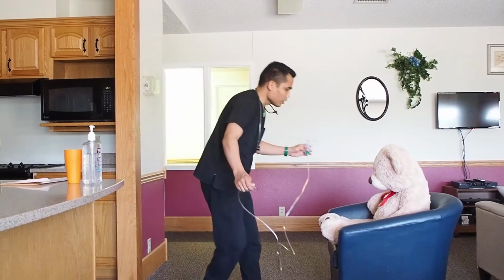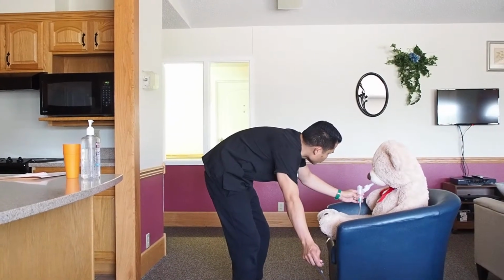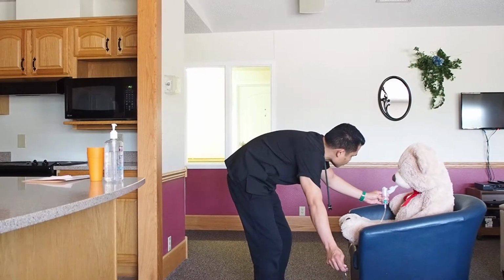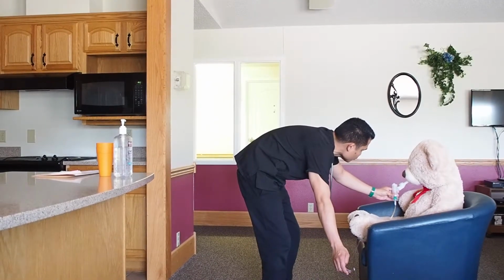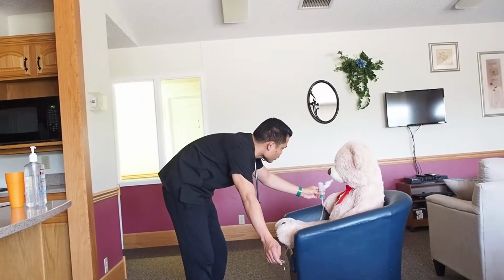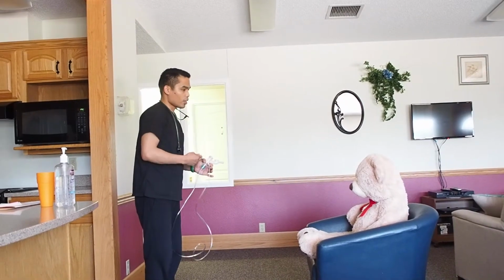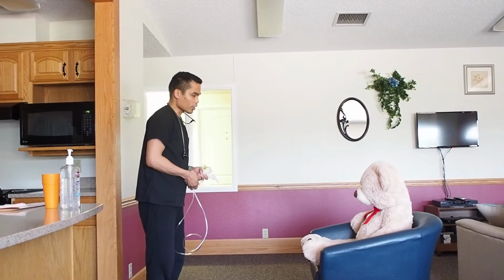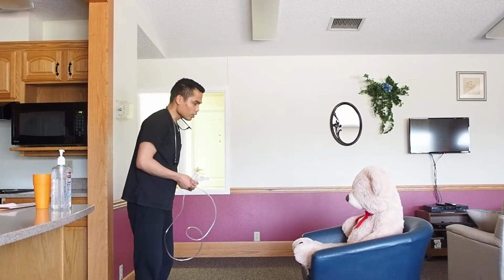Okay, so I'm going to use a compressor. Place the mouthpiece inside your mouth. Okay, do normal breaths. Okay, very good. Continue with occasional deep breaths. Okay, so I think we're done taking this medication. So before I let you rest for a few seconds, can you deep breathe and at the same time cough for me? Okay, thank you.